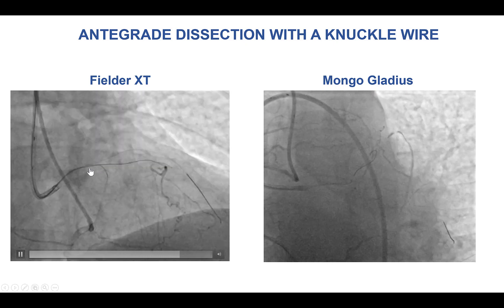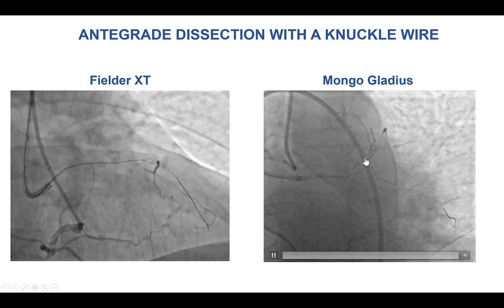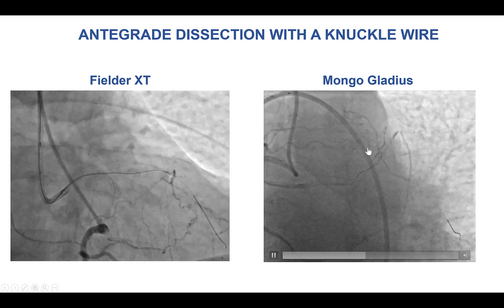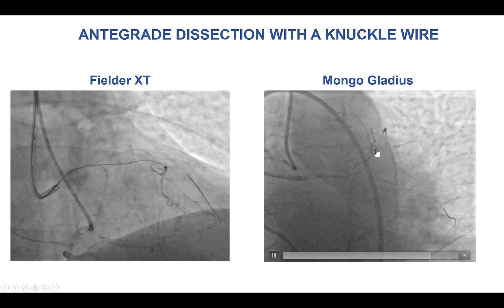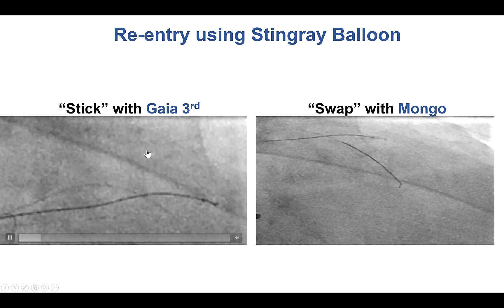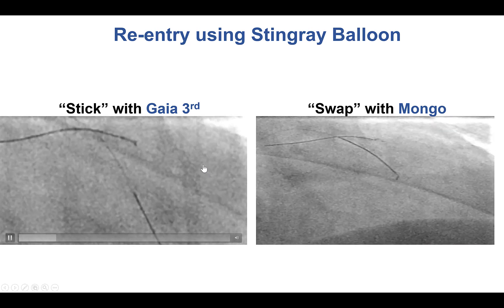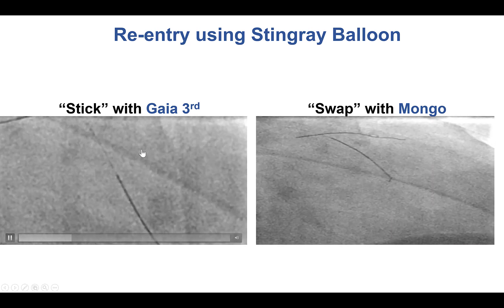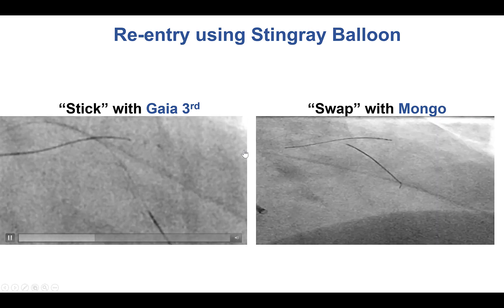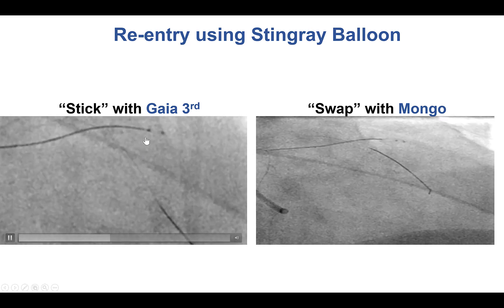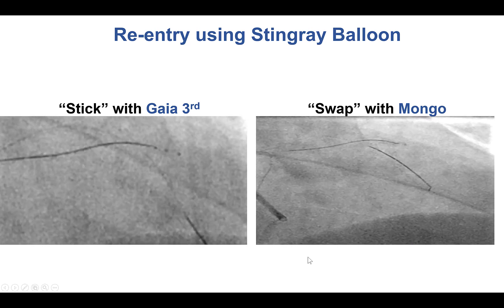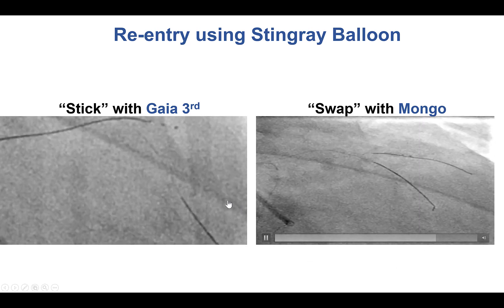After that, we were able to advance a Fielder XT, which seemed to knuckle in the course of the vessel, followed by a Mongo Gladius wire. We were then in the mid-LAD and decided to re-enter using the stick and swap technique. Unfortunately, once subintimal in the mid-LAD, we had poor visualization from the right coronary collaterals.